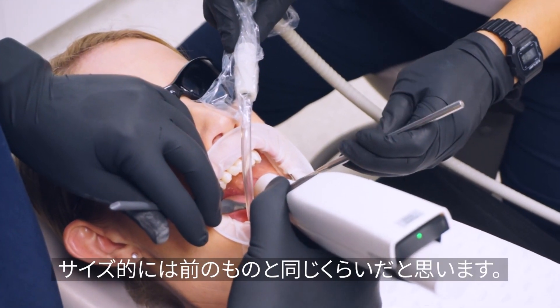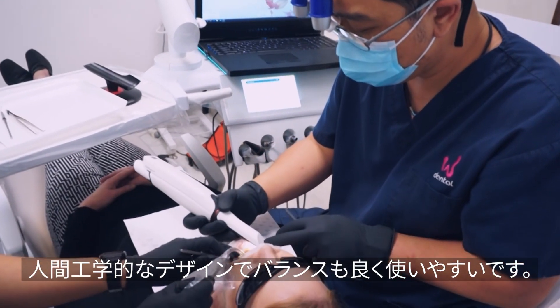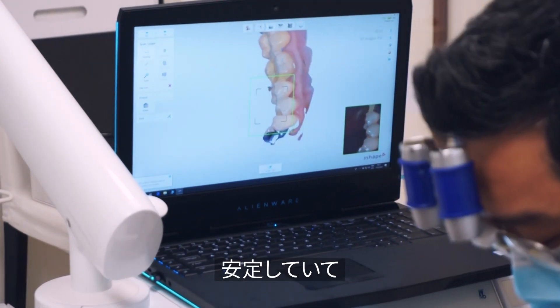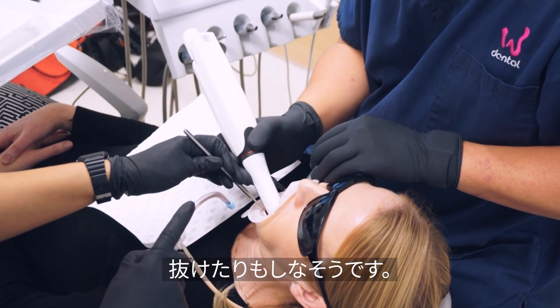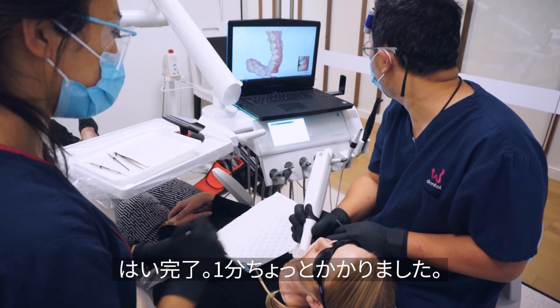It seems to be a similar size to the previous model — nice and ergonomic, pretty well balanced. I really like the new tip; it's nice and firm, doesn't come out, and the battery life seems to be better as well.